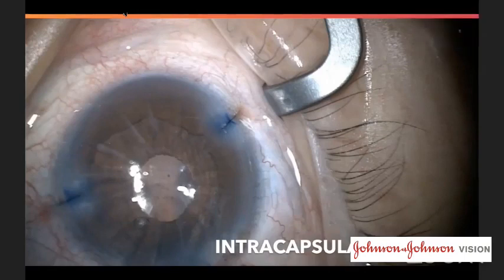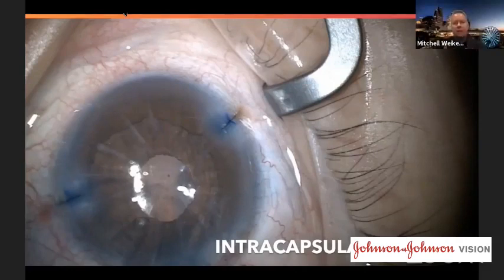If you've got an atrophic iris and it's changing the color, which might contrast pretty highly against the implant that's behind it, you can actually remove some iris with the vitrector. It's good to leave a little bit of iris all the way around peripherally, especially with sulcus implantation, which I'll talk about next. But you can take your time and gauge how much iris you're going to remove to get your best cosmetic appearance.